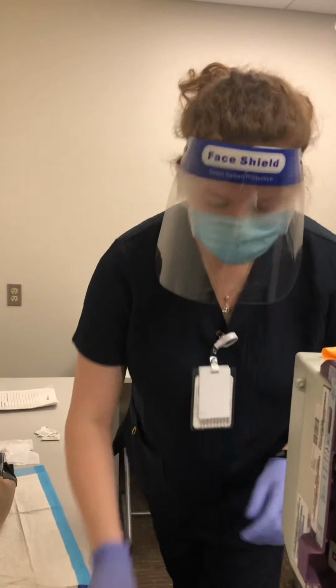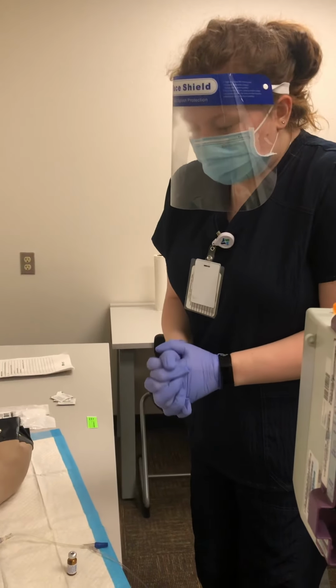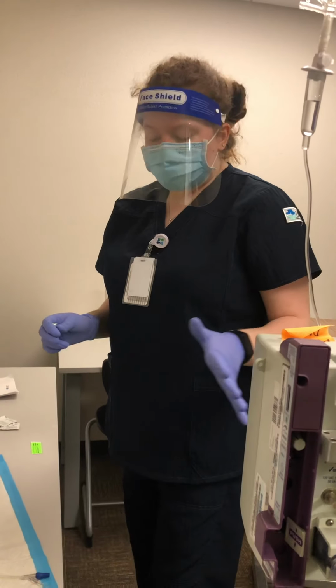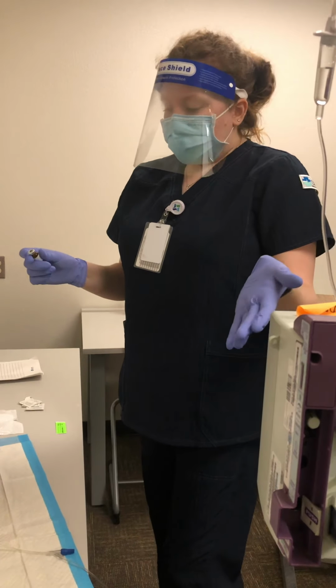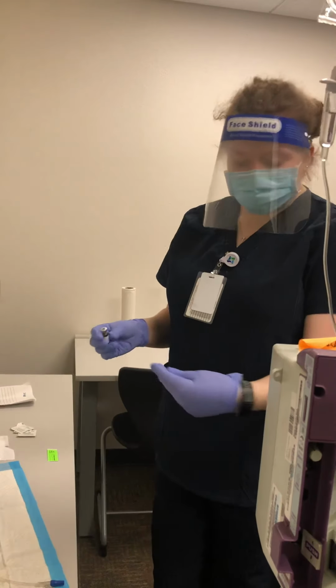Okay, you don't need that cap anymore, I guess. So, okay, Shirley, if everything's good and again the IV line looks fine, I'm going to make sure she has her call light, remove my gloves, do hand hygiene, and remove privacy, and I'll be back in 30 minutes to reassess.